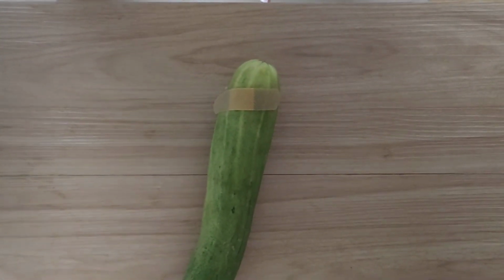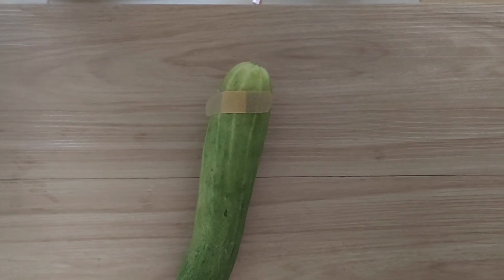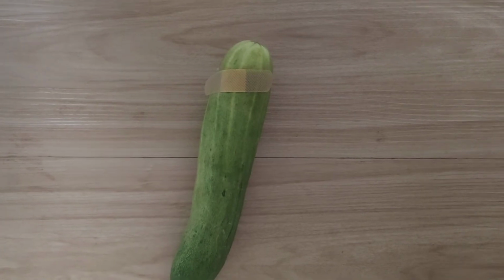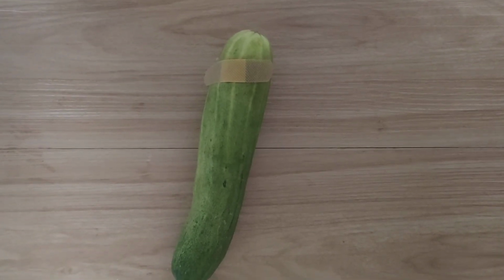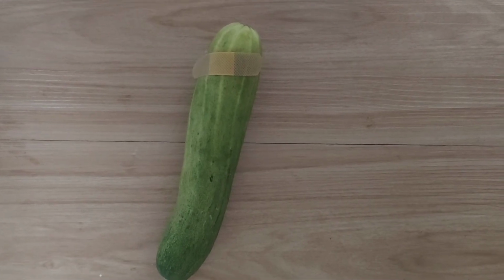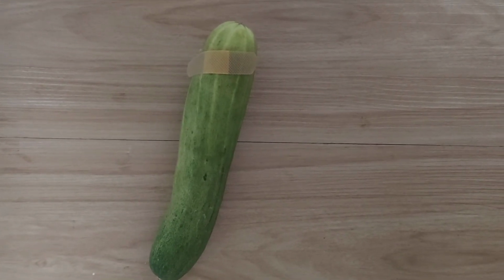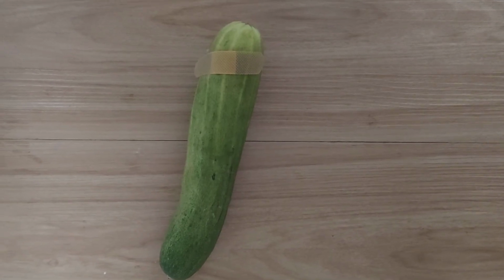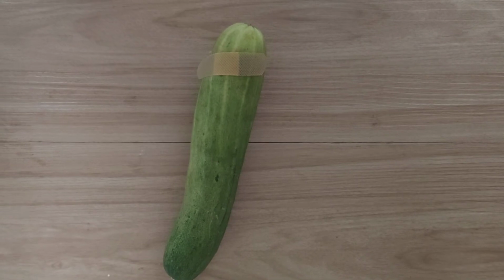A slow gradual thrust will promote arterial entry without passing directly through it. Enter at an angle comfortable for stabilizing your hand. Certainty of position is more important than entry angle. Pulsation of blood into the syringe verifies that the artery has been punctured. Flashback occurs readily with a glass syringe. Gentle aspiration may be necessary with the plastic syringe.